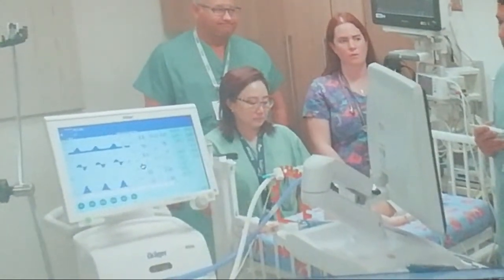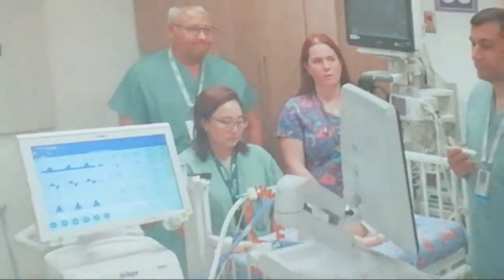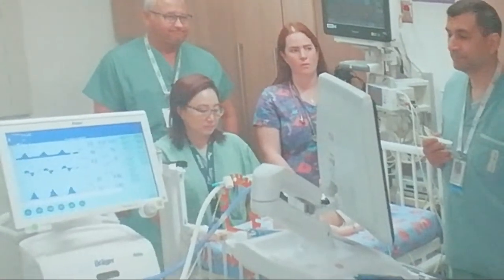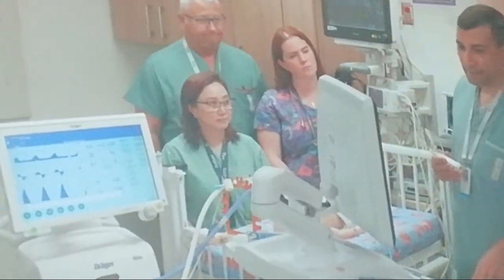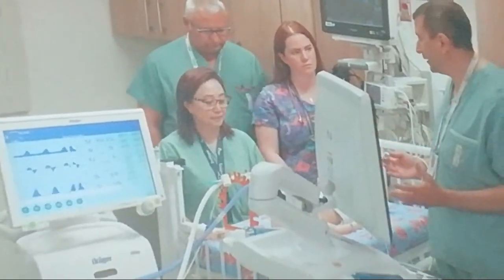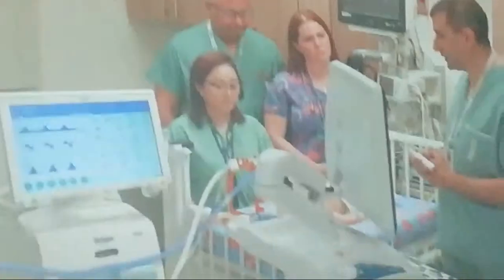We assess for a hemodynamically significant PDA by echo. At the same time, we have to assess the filling volume of the heart before the next attempt to increase the distending pressure of the lung. Hi everyone, thank you for asking me to do the targeted neonatal echo exam as part of the hemodynamics assessment for the mechanism of hypoxemia.